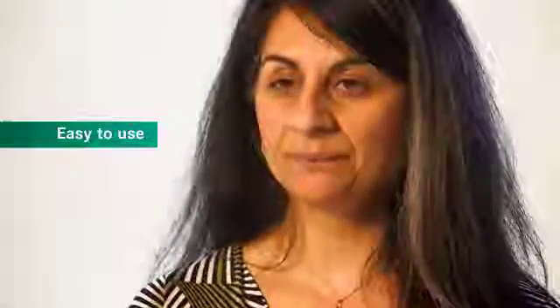The KOWA nonmyd digital stereo camera is very intuitive to use. It's very easy to pick up. What I would recommend is that before you start using it, familiarise yourself with all the buttons. There's an ability to reduce the flash intensity setting just in case it becomes a source of glare when you're taking an image. There's a button that will adjust the illumination of the fundus if you have different pupil sizes or different amounts of light getting in. So just be aware of where everything is.